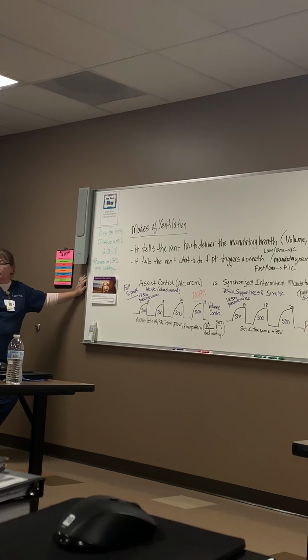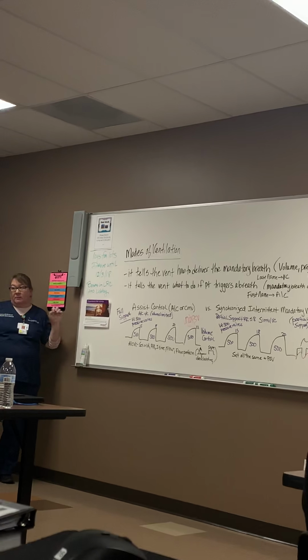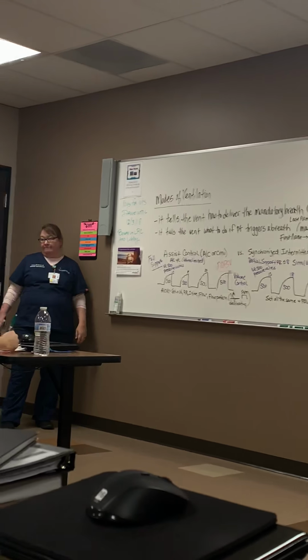The tidal volume doesn't fluctuate on SIMV? Not on the mandatory breath, only on the patient one. That's why, if you're reading the vent, it can vary, just because it's patient determined.